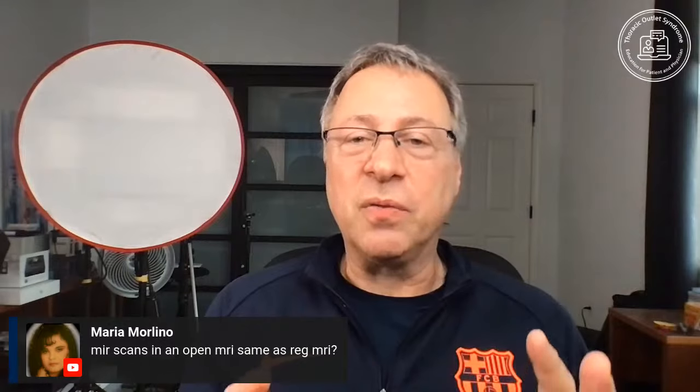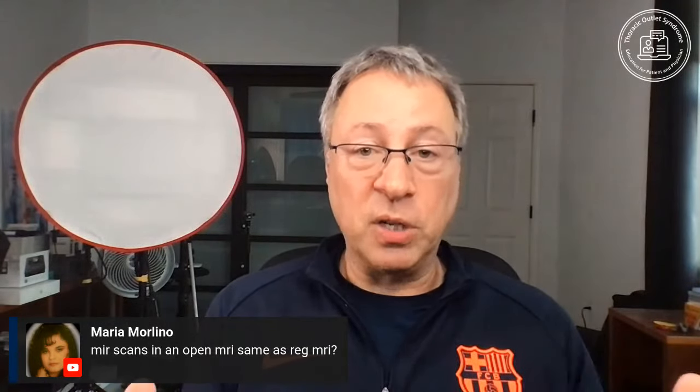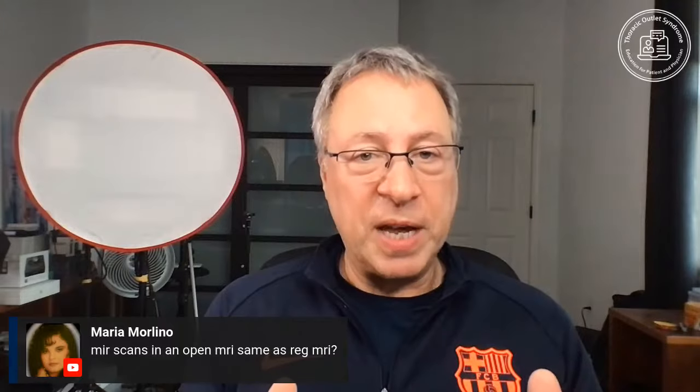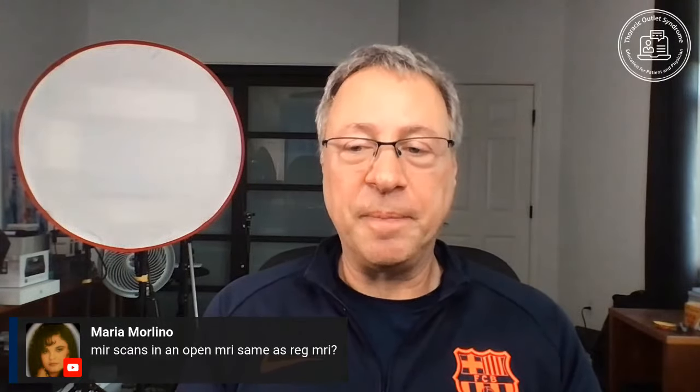I would say this, for my purposes, to make the diagnosis of TOS, to provide your doctor with the necessary information, 1.5 Tesla magnet is plenty. If we have a 3 Tesla, we might get some more information, but not at all necessary.